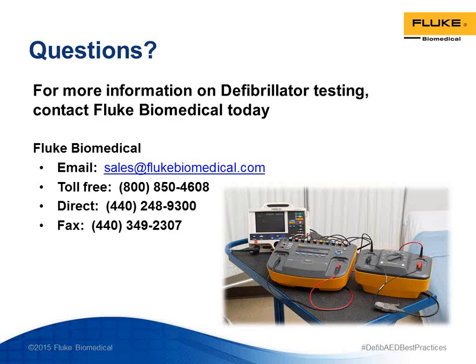Okay, here's another question for you. What are the most common problems with a defibrillator? That's another really great question, and I think the answer will vary some. If you look at the databases, the CMMS or computerized maintenance management systems across the biomedical and engineering community, you can always assume that the things that are out in people's hands and connections that are made externally are going to fail first. That includes trunk cables, ECG lead wires, any oximeter sensor cable, all of those cables and patient connections, including the defibrillator cable and paddles, or the trunk cable that goes to the disposable defibrillator pads.